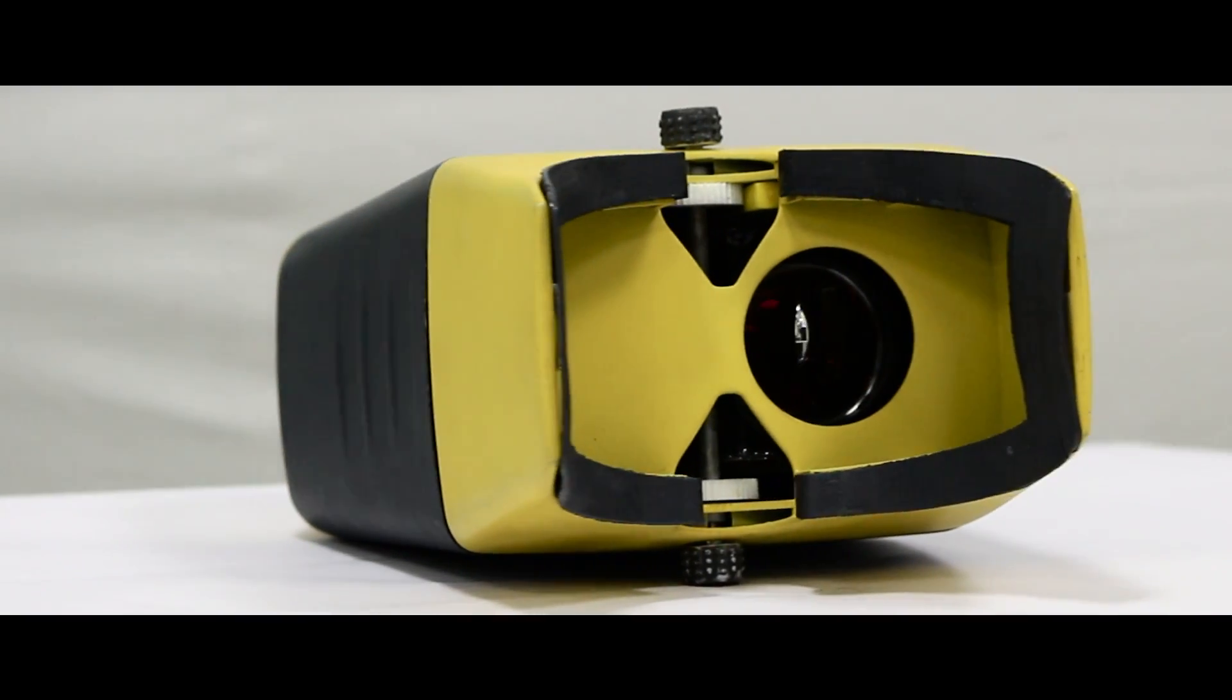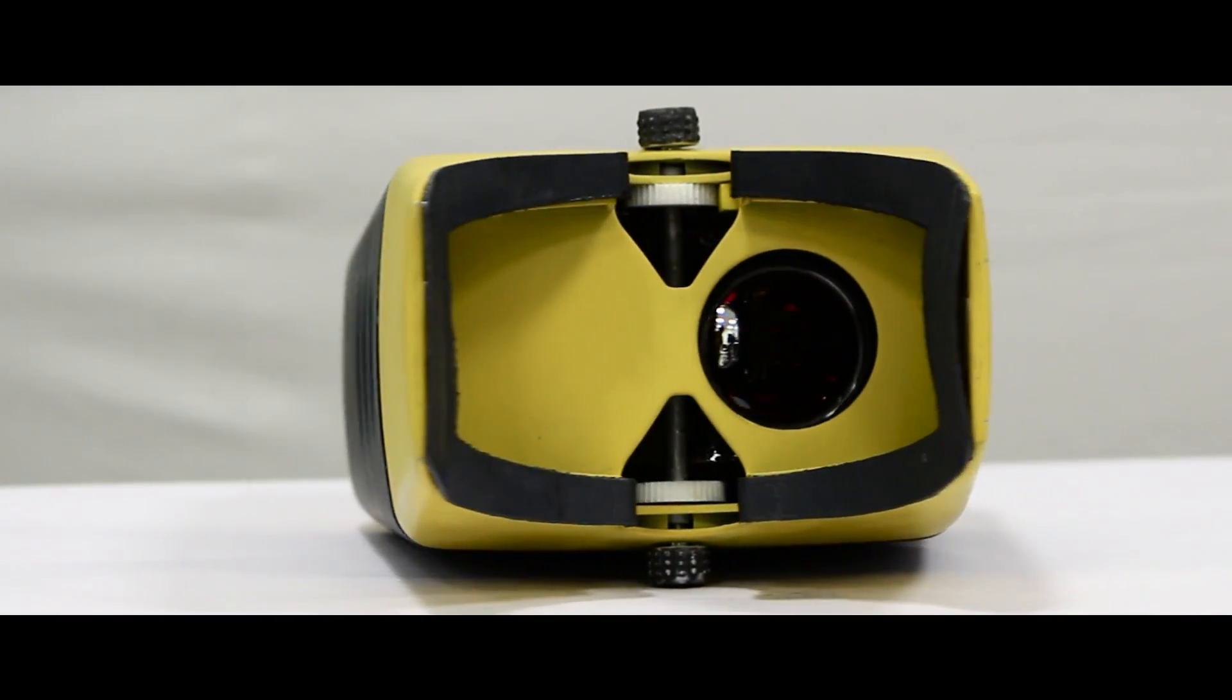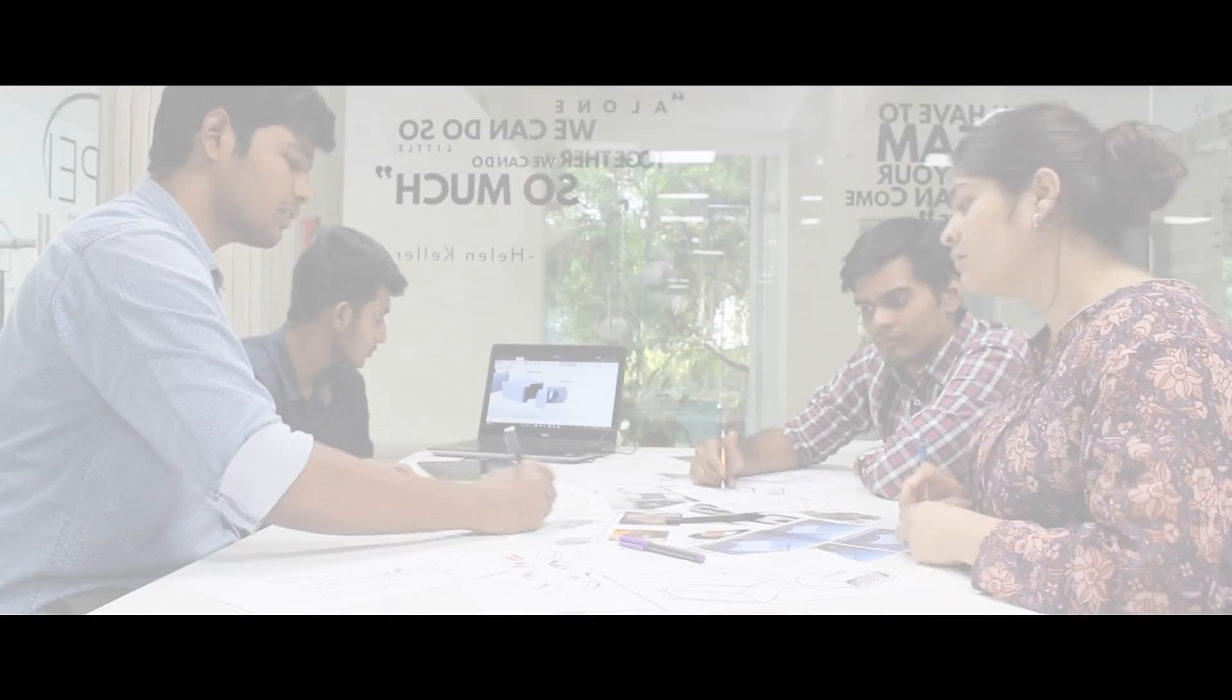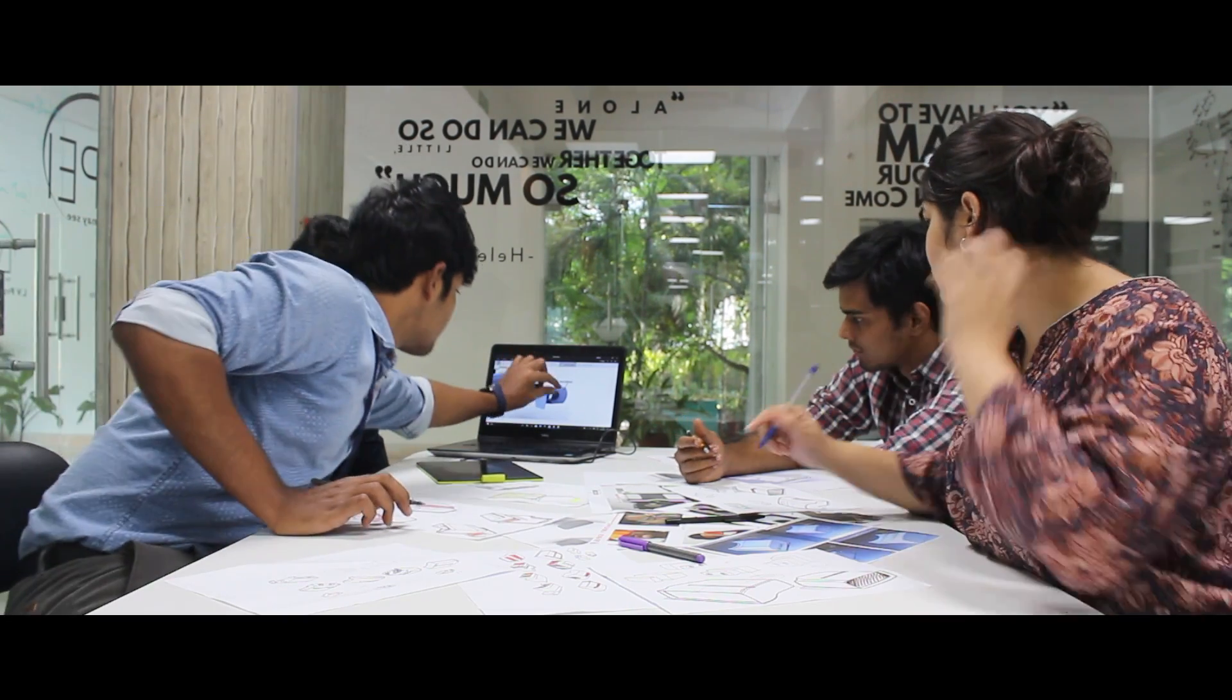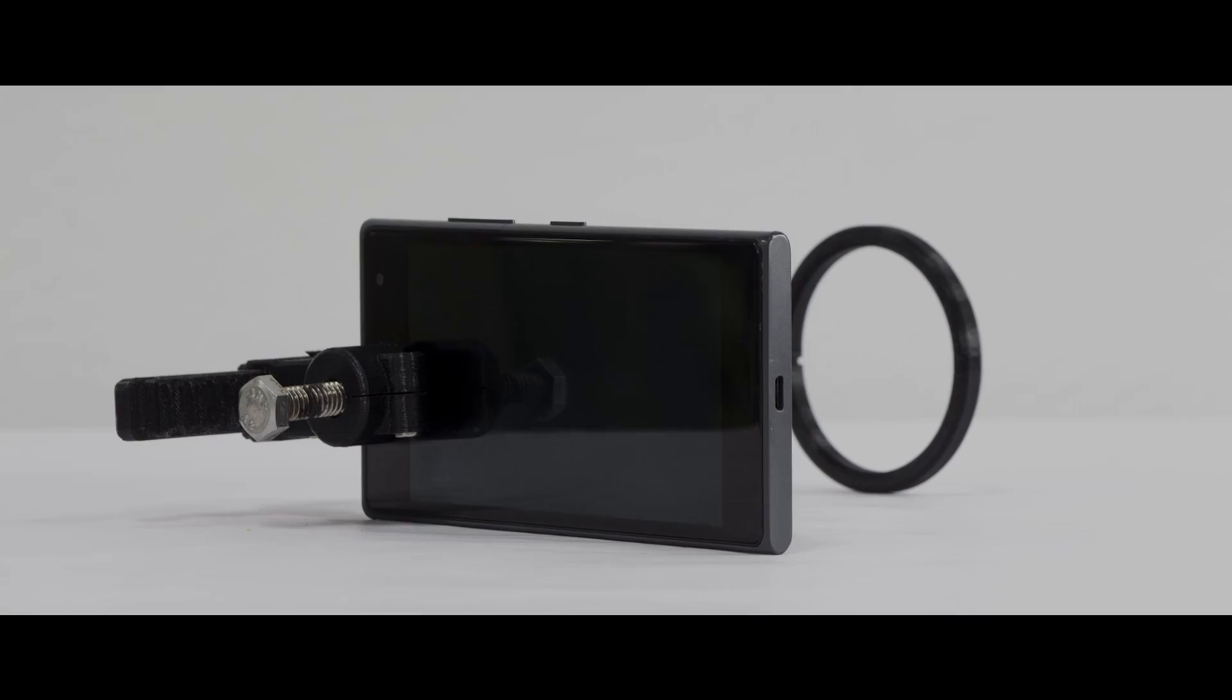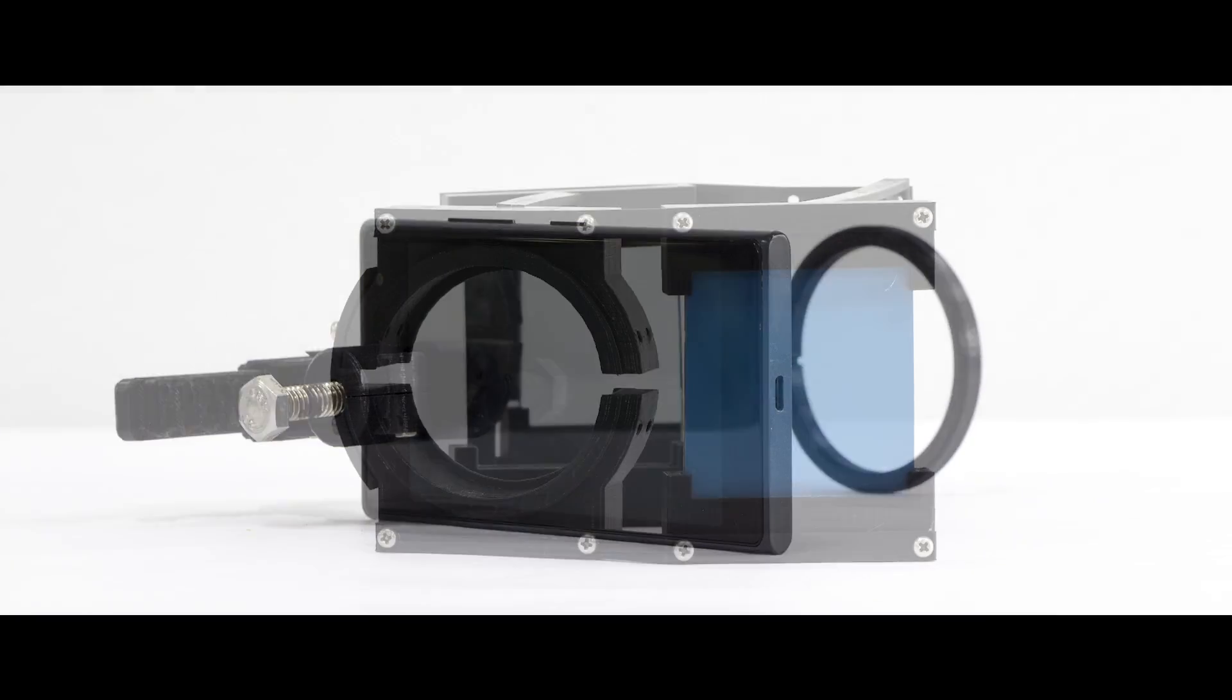Our dedicated team of designers and engineers strive to build an open device that can be easily printed and assembled anywhere in the world.